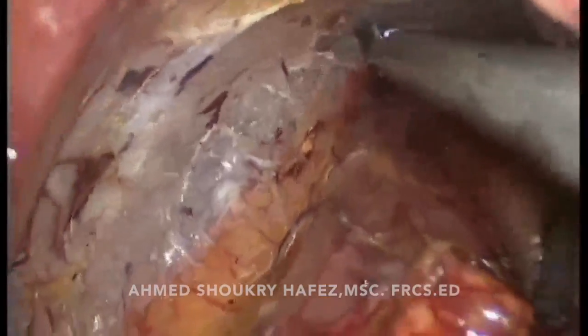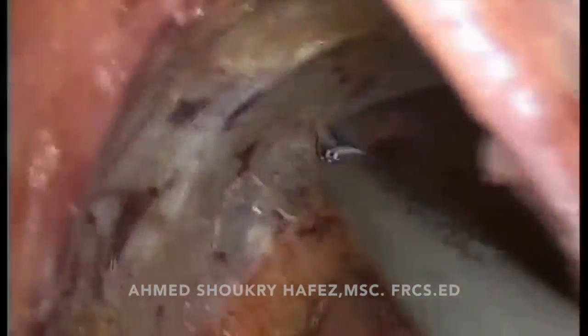This is the level of the inferior pulmonary vein, and this is the end of our mediastinal dissection.